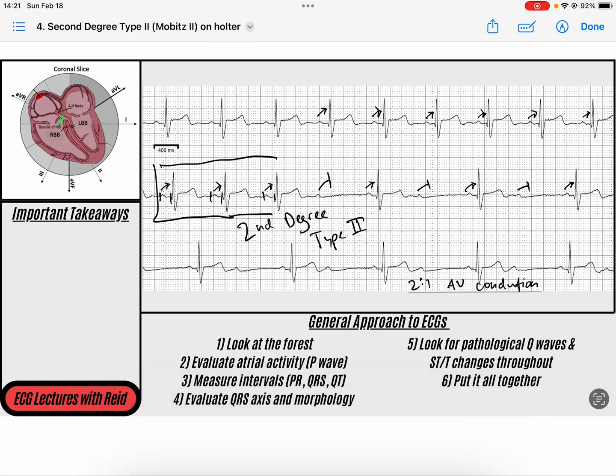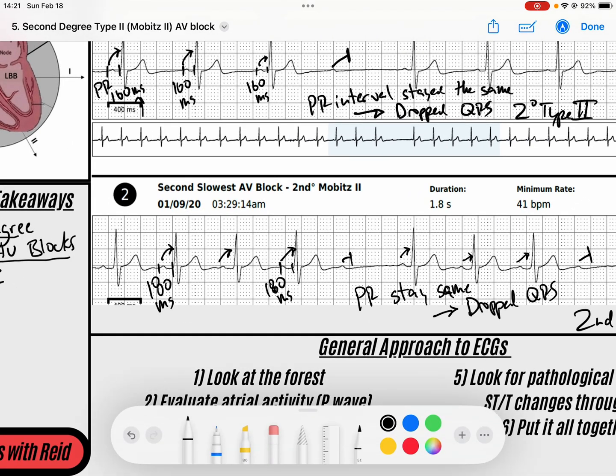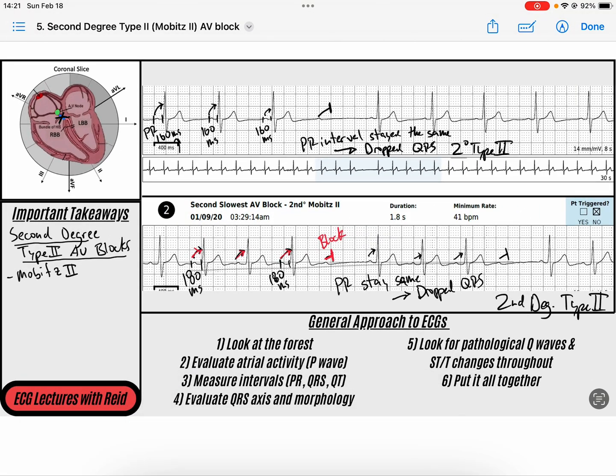Let's review. What is second degree type 2? It's when the PR interval stays the same and then it drops, because of all or nothing conduction. So we have P, QRS, P, QRS, P, QRS - the PR intervals all stay the same, and then we drop. That's a block. That's a second degree type 2 AV block.